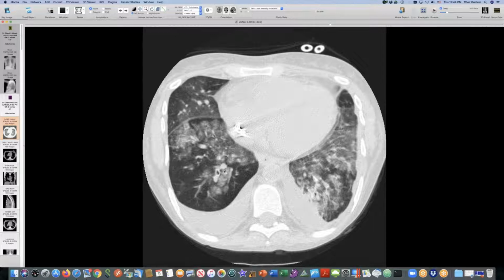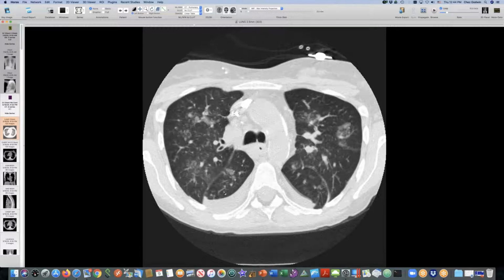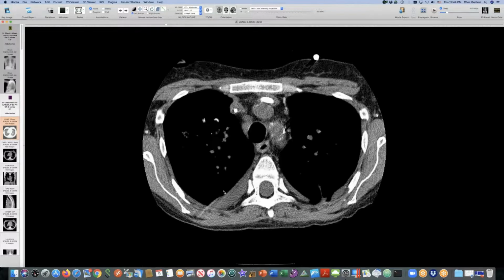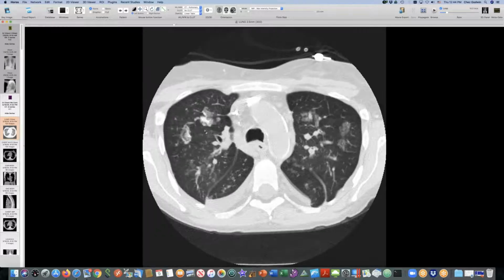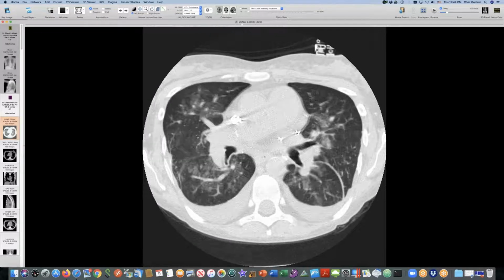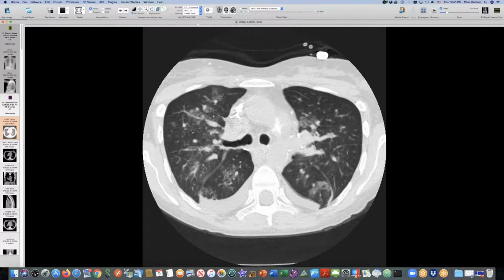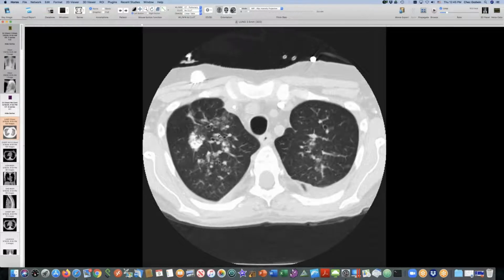To me, this reminds me of cauliflower, these blobs on blobs and the sparing of the lung nodules. You see this sort of pattern with pulmonary hemorrhage, but you also see it with metastatic calcification. And then in the upper parts of the lung in particular, the calcification is denser. So there's a range of different densities of these lesions in the lung. Some are just soft tissue density, some are mildly calcified, and some are densely calcified. And this is metastatic calcification.